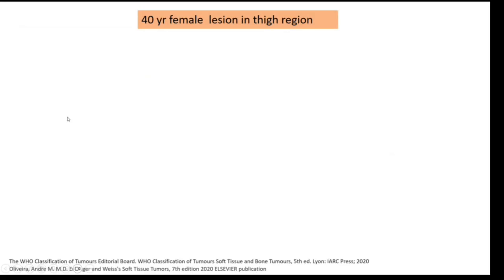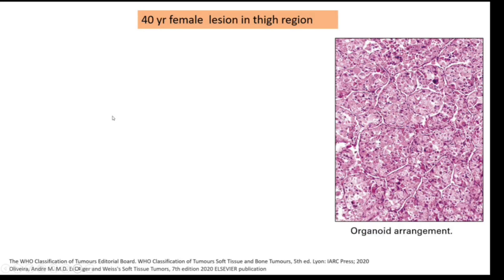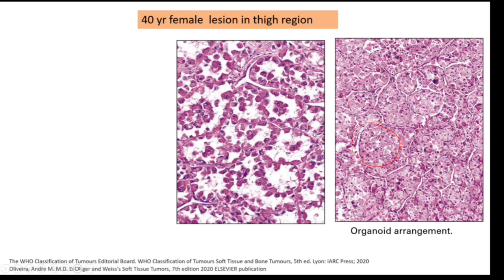A 40-year-old female presented with a lesion in the thigh. The first pattern of arrangement seen here is called the organoid pattern. What is this next pattern of arrangement?